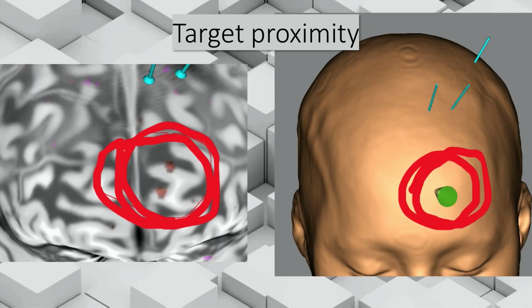All right. Another issue is whether TMS close to the face feels better or worse than targets that are more posterior. We get it worse. All right, audience participation, everybody agrees that's worse.